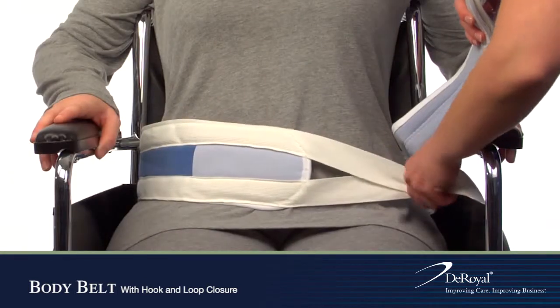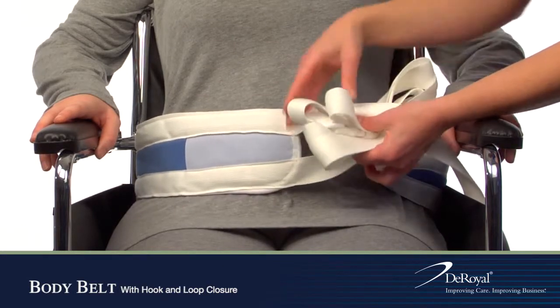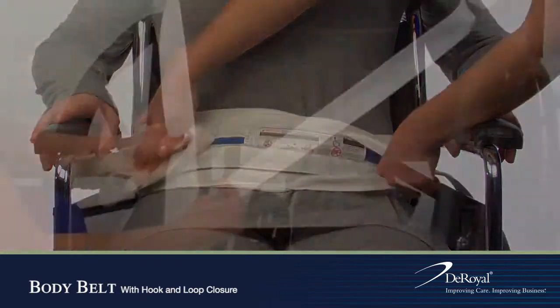Place the belt around the patient's waist. Feed the narrow strap through the V-slot and secure closure. Feed the straps between the wheelchair armrests.